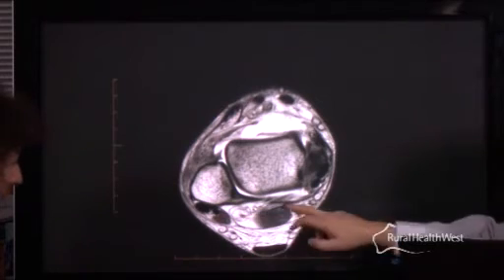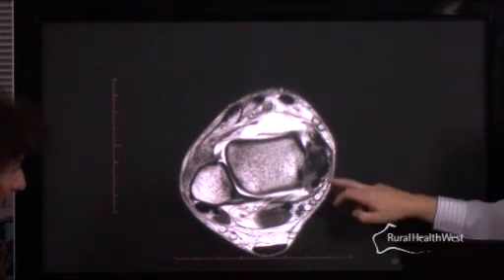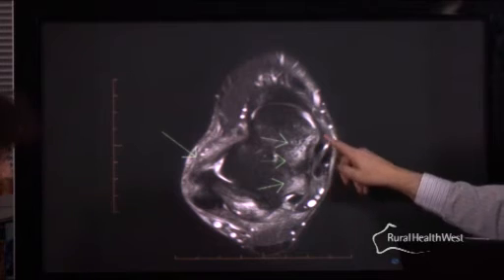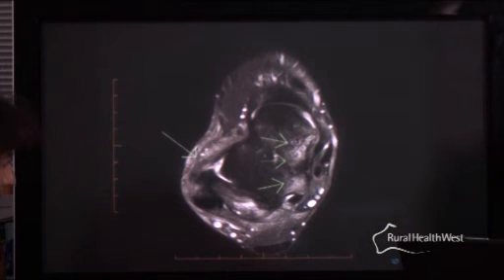These are tendons which you're seeing. These were the peroneal tendons, and these are the flexor tendons and the extensor tendons anteriorly. So you see them well on MR. And again, when we alter the sequence, you can see changes within the talus, which would suggest that there's been extensive bone bruising associated with this injury. Torn enough of the ligament to really bash the bones against each other and bleed. Yes, and impact them and end up with bruising of the bone there. So he's got a fairly significant injury and that would account for his presentation.